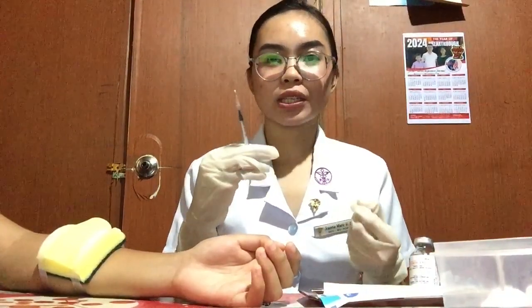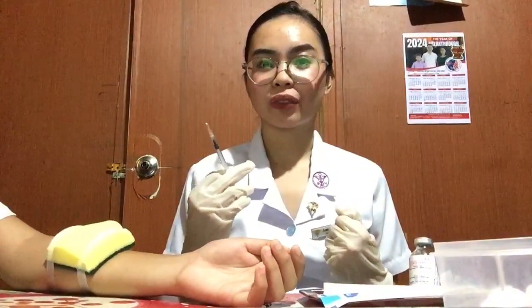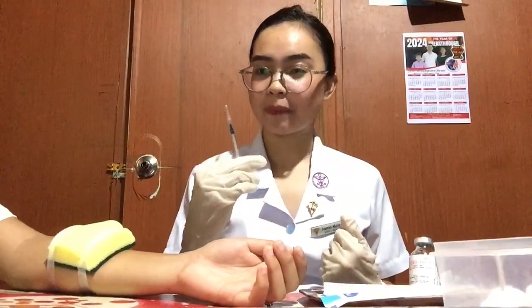Now carefully insert the needle into the upright vial through the center of the rubber cap, maintaining the sterility of the needle. Since I'm done doing it, now inject the air into the vial, keeping the bevel of the needle above the surface of the medication. Now withdraw the prescribed amount of the medication using either of the following methods.